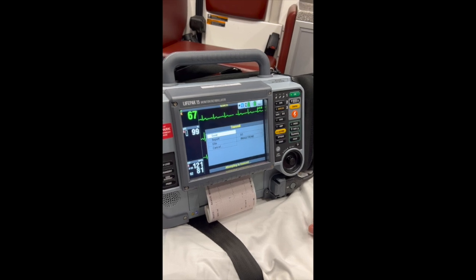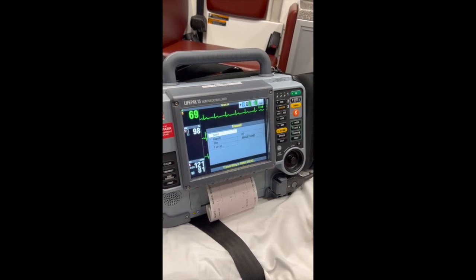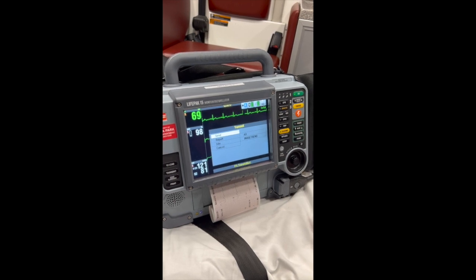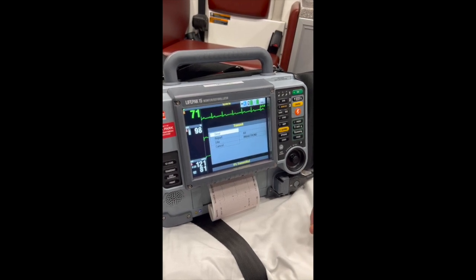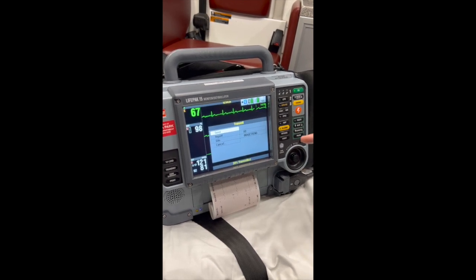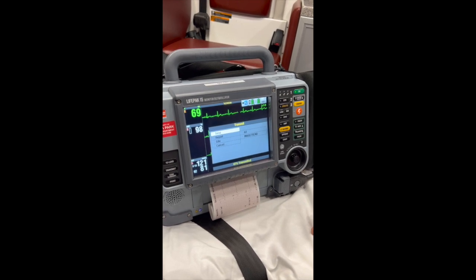Once everything is transmitted, it'll spit out a ticket saying transmit complete. Because we have several pieces of data in here, blood pressures and monitoring situations, it's taking a while to send to the ImageTrend server.